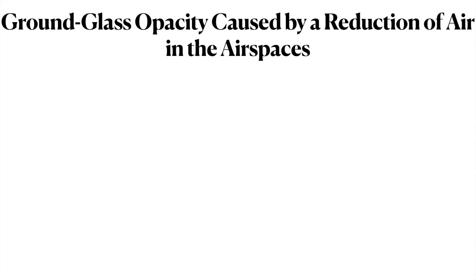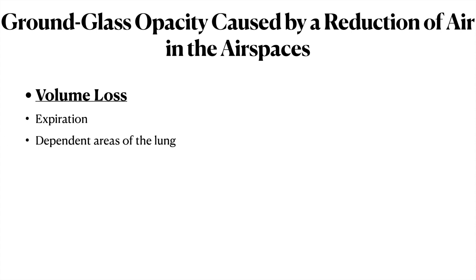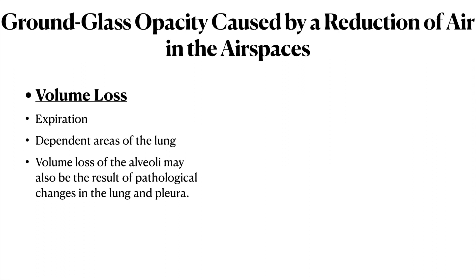Ground glassing caused by reduction of air in the air spaces occurs due to volume loss. This can occur physiologically during expiration, in the dependent areas of the lungs, or pathologically when the lung parenchyma is unable to expand fully due to some pathology, resulting in reduced air in the air spaces.